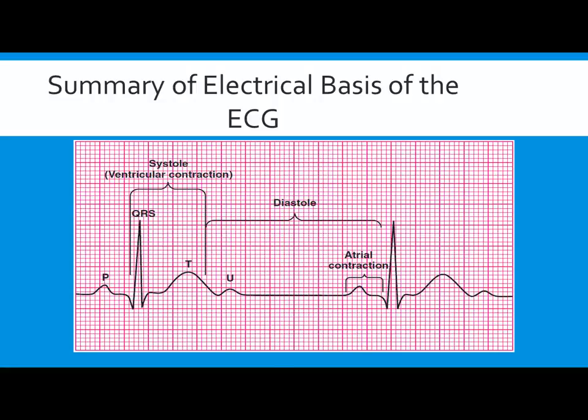All right. So let's quickly look at this again. Repetition. I'm looking at the start of the P wave to the beginning of the QRS complex. What is that segment called? The PRI segment. Or the PRI, the PR interval. What is the normal time for that? Yeah, 0.12 to 0.2. Okay? So, let's just look at it together right now.